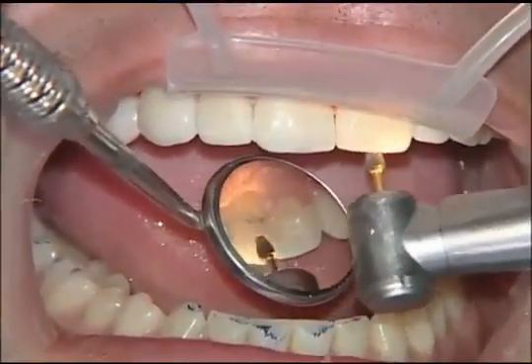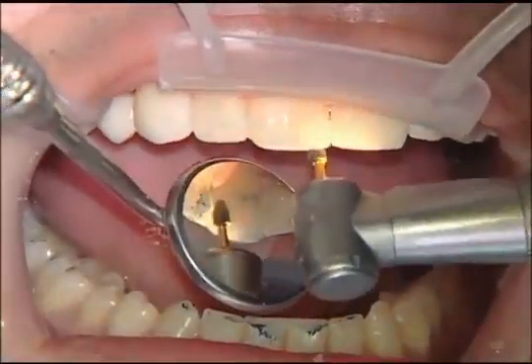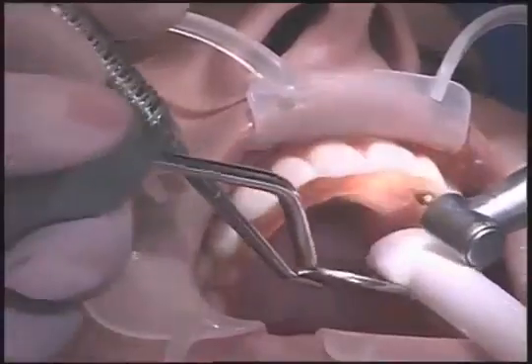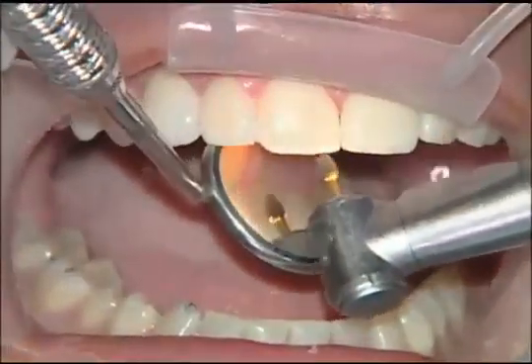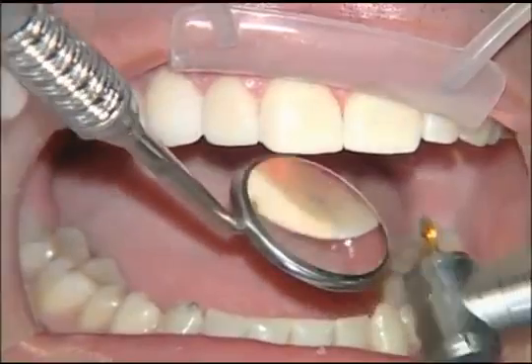So we use the 7408 to not only remove any excess cement, but to take care of any excursive areas that we want to remove from the ceramic material, or in fact if we do have an area where we do have a high spot. The 7408 at relatively slow speeds does a good job of removing ceramic material without causing a lot of the roughness that you can have with something like a diamond. If I'm going to use a diamond for this purpose, I will use a very fine diamond, like a 30 micron diamond football burr.